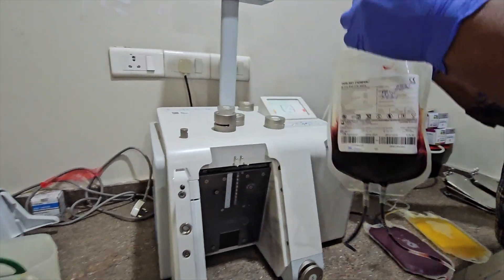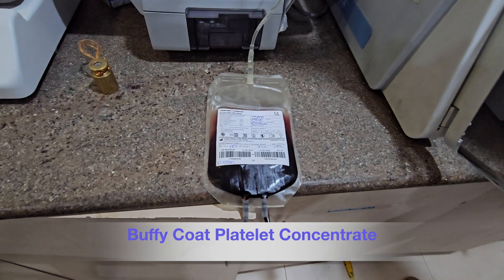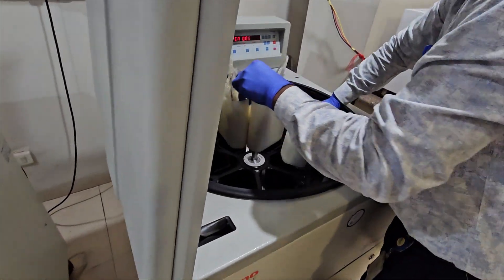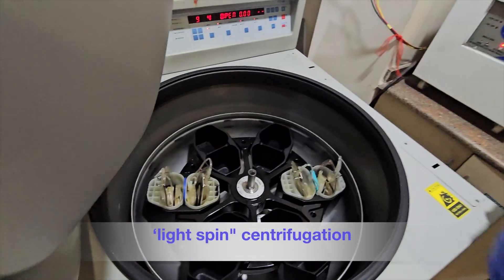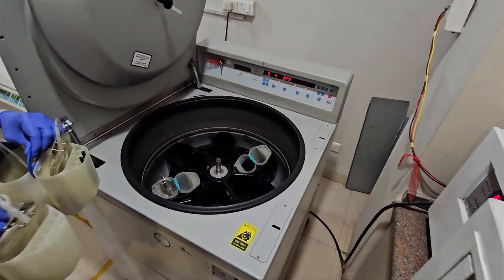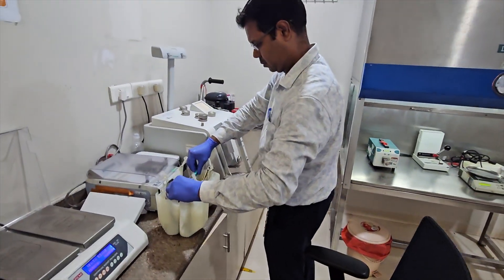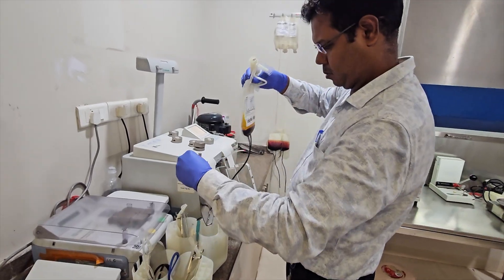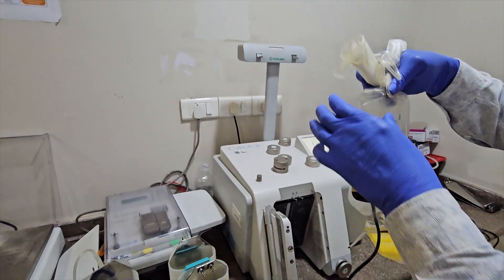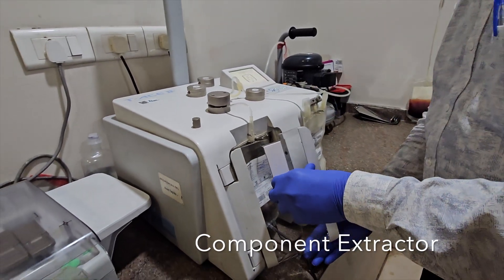The remaining part is the Buffy coat platelet concentrate. It is again subjected to light spin centrifugation at 22 degrees centigrade for 6 minutes.